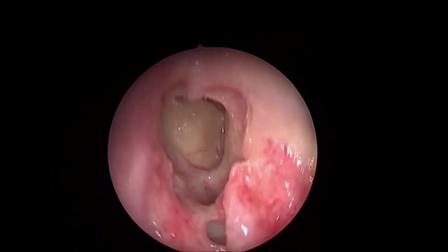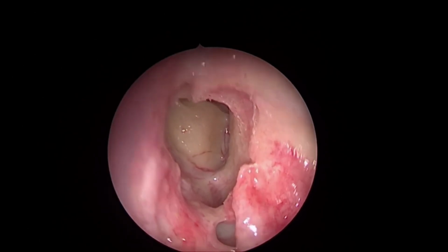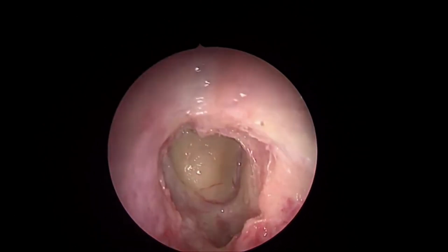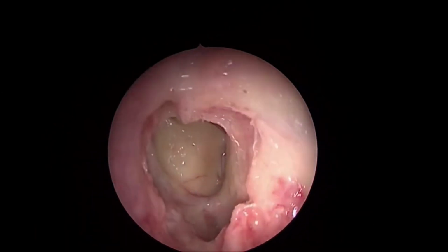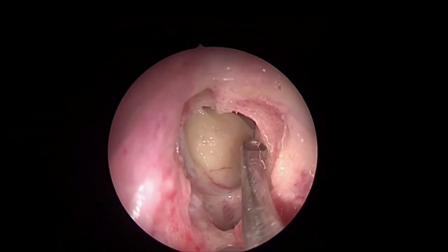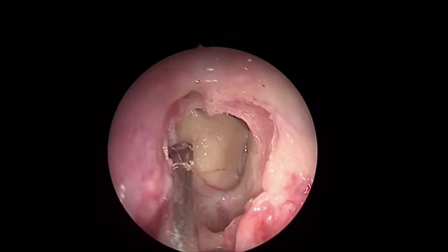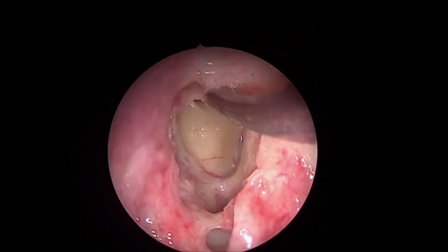the box: the frontal sinus outflow passes through a box, the fixed anatomy, that is, a box of bones all around. We need to take advantage of that anatomy. See, I have not changed the anatomy. Whatsoever the cellularity is here in between, your limits are the same. Your lateral limit, the orbit, is going to remain the same. Your medial limit, the turbinate, is going to remain the same. The beak is going to remain the same.